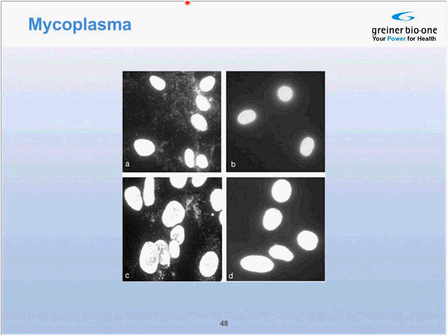The best way to detect Mycoplasma contaminations is with a PCR, as this gives also definite information on the source of the Mycoplasma. With CytoCheck, Greiner Bio-One also offers a convenient kit for this purpose.